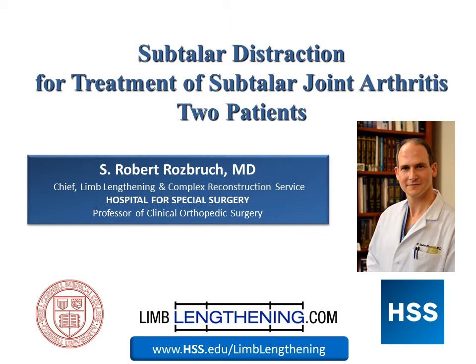Hello, I'm Dr. Rob Rozbruch from the Hospital for Special Surgery, and I wanted to spend a few minutes talking to you about subtalar distraction for the treatment of subtalar joint arthritis. This is a joint preservation approach to arthritis of the subtalar joint and is an alternative to subtalar fusion, which eliminates motion in the subtalar joint.